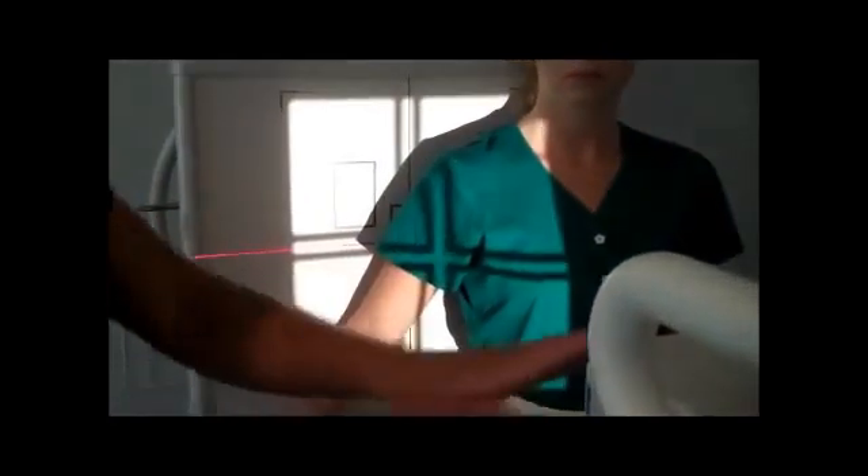With external rotation, it will place the greater tubercle and the humeral head in profile. Our tube is lined up to the bucky. Now we want to collimate to the humerus, since our central ray is entering the midpoint of the humerus.